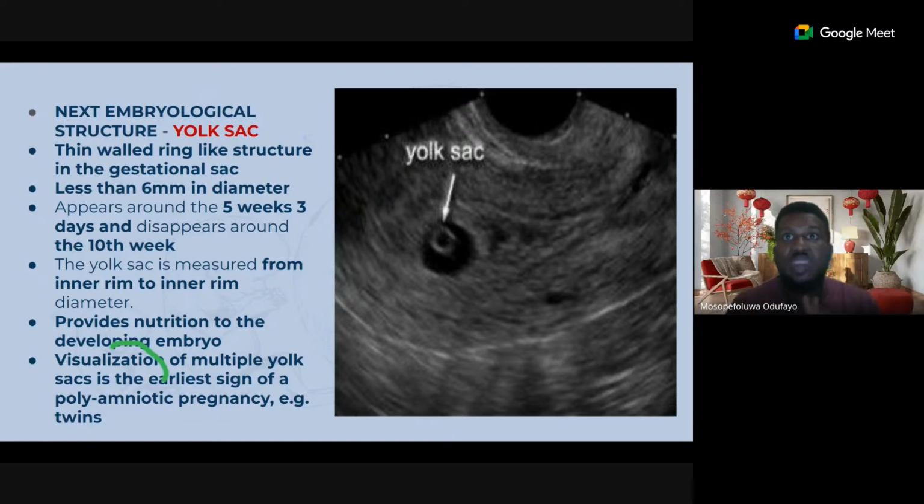So it's either you have a very good transabdominal ultrasound curvilinear probe that can see the intradecidual sac sign, or you just go straight to a TVS to look out for it properly. Or you tell the person to come back when they are about 5 weeks to see the double decidual sac sign, which is a little bit more prominent on transabdominal.